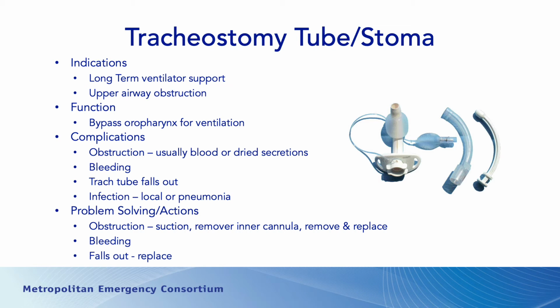Infection is also a complication, either locally or as a consequence with pneumonia. When you put a tracheostomy tube in, you are bypassing the protective mechanisms we have in our nose and throat to keep bacteria and other things from getting down in the lungs. So patients are more likely to get a pneumonia with a tracheostomy.